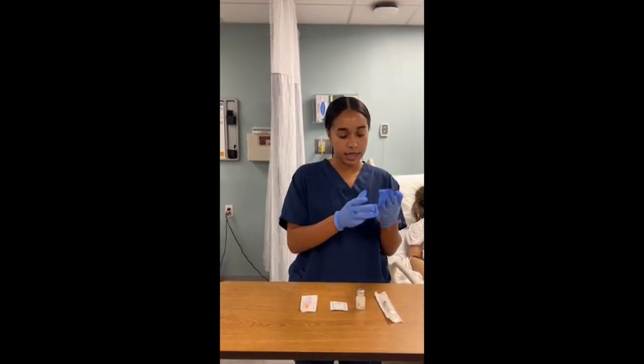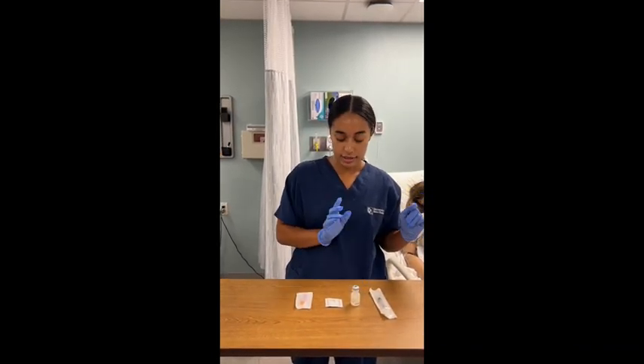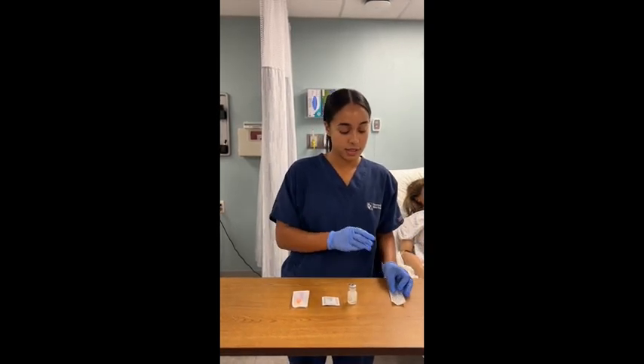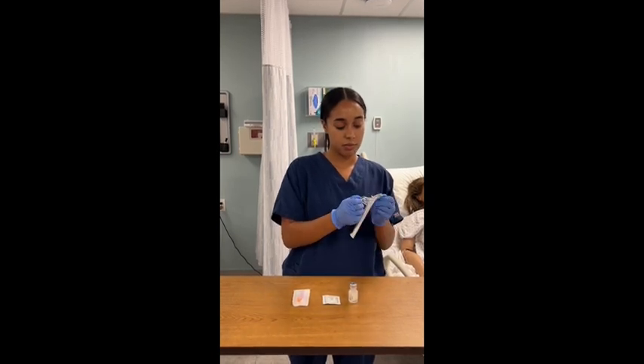I have all my supplies. I have my syringe with my blunt needle on the end, my medication, alcohol swab, and a needle. So first I'm going to take my syringe with my blunt needle.